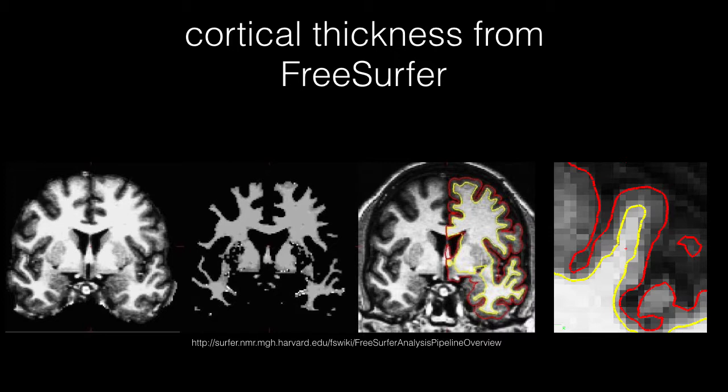FreeSurfer then inflates a copy of that white matter surface until it finds the boundary between gray matter and cerebral spinal fluid. That's the gray matter surface shown here in red. The voxels that are sandwiched between those two surfaces are then of course labeled as belonging to the gray matter ribbon. Not only is this a very efficient way to label gray matter ribbon voxels for calculating the volume of the gray matter ribbon, but it also provides a second metric, cortical thickness.